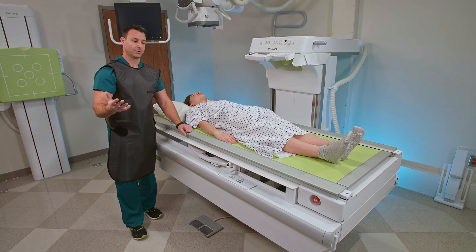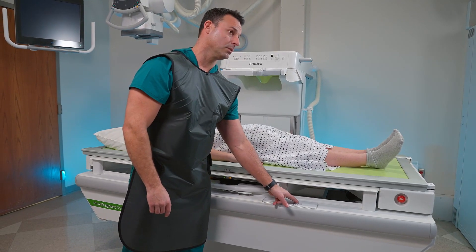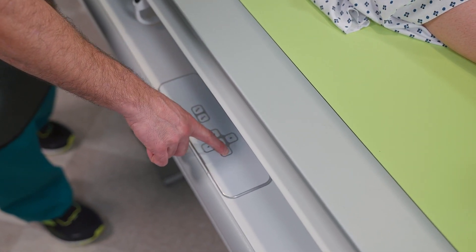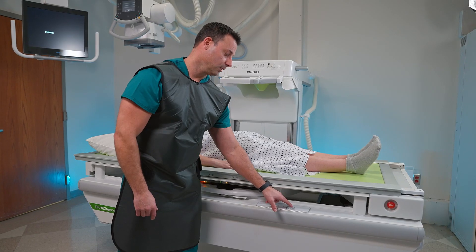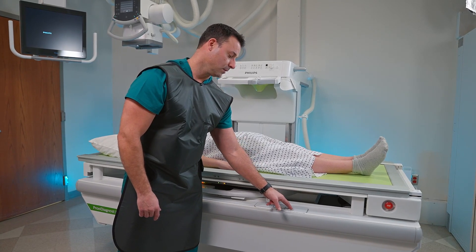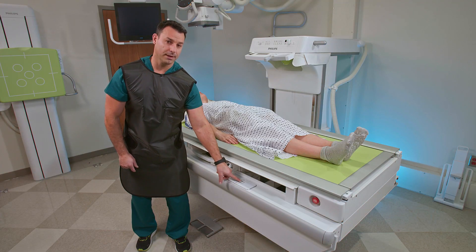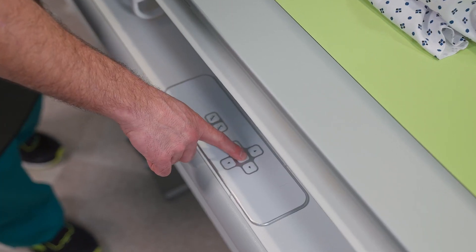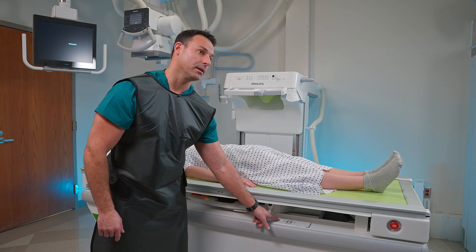The next feature is the table movements. You've got buttons on the side of the table for all your table movements — you can move right to left and head to toe. There's a button in the middle: if you hold that down, it will center your tabletop to your table bucky. We also have the ability to tilt the table from the side as well.